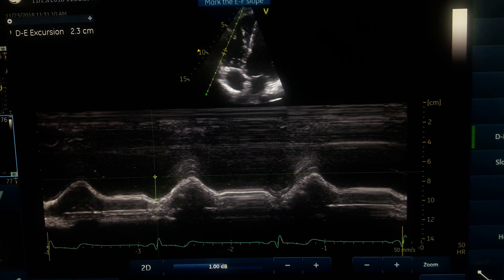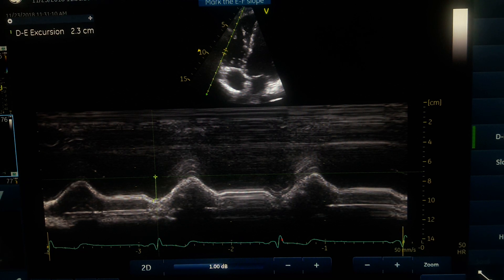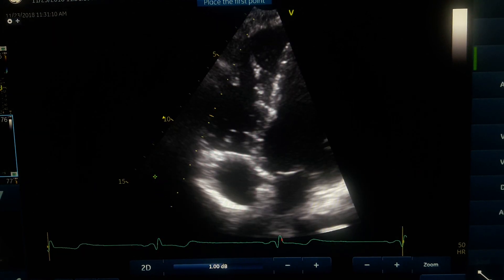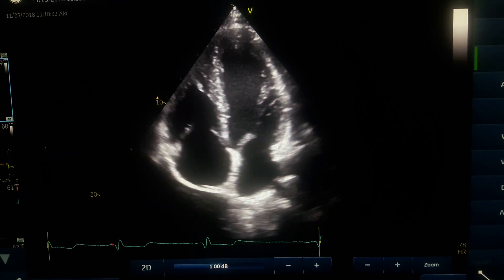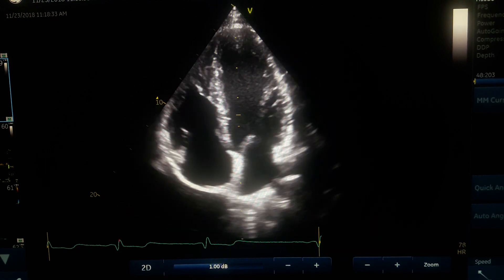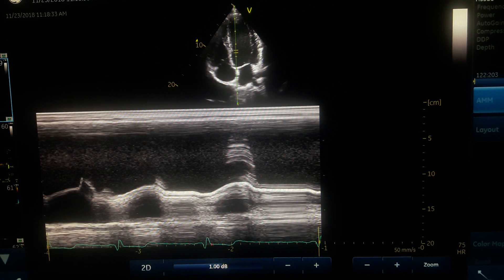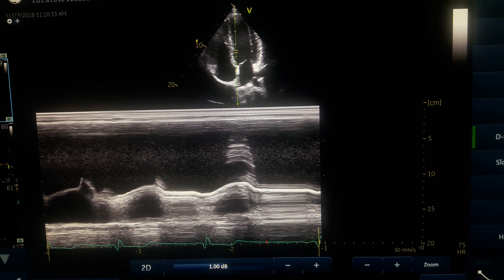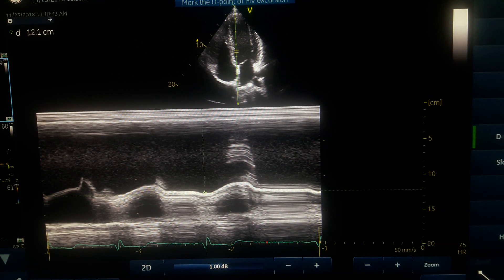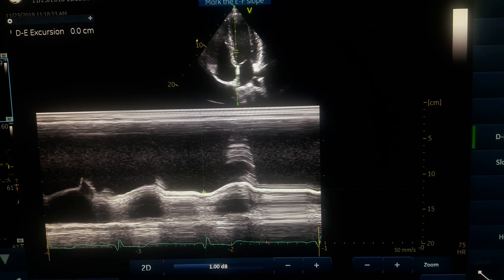For MAPSE, we actually have three sites for measurement: medial, lateral, or anterior annulus. For any of these, obtain a good four-chamber view, then start with the medial annulus — place the cursor exactly at the medial annulus and hit M-mode. You will see the resulting image, then measure the amount of excursion from the lowest point to the highest point.